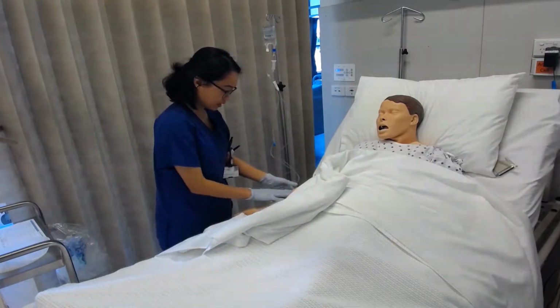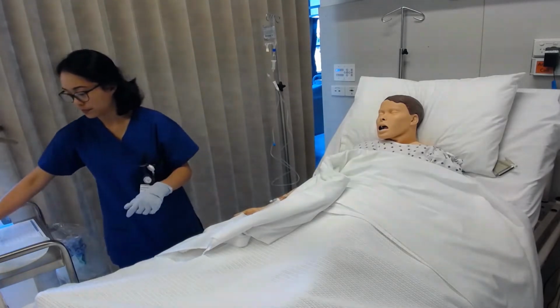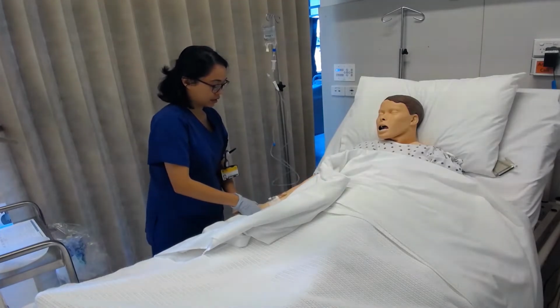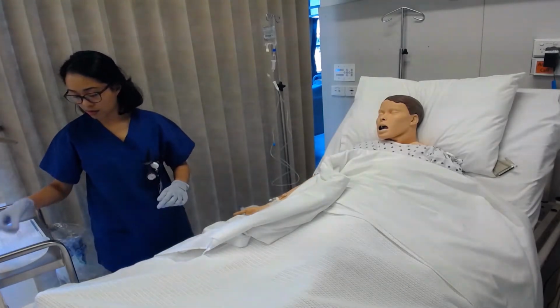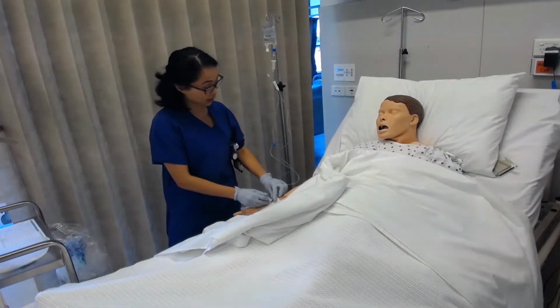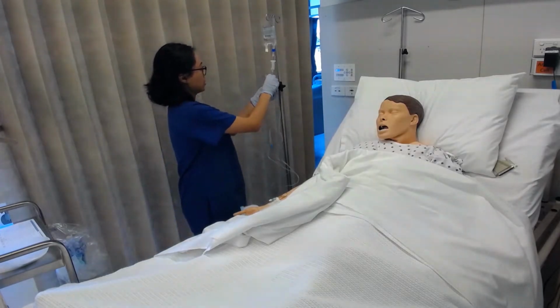I'm now donning non-sterile gloves in order to assess the IV cannula site and its patency. I'm going to show you a couple of different angles when it comes to assessing the IV site and swabbing it with an alcohol wipe and connecting the IV tubing.